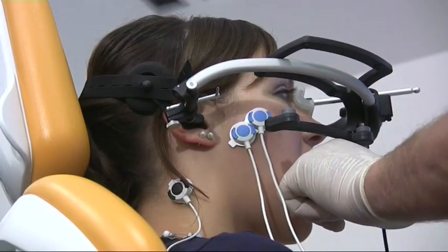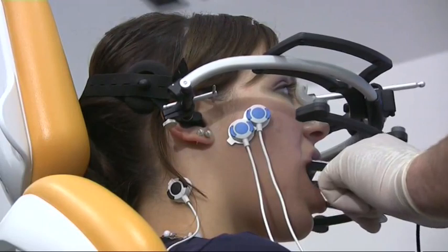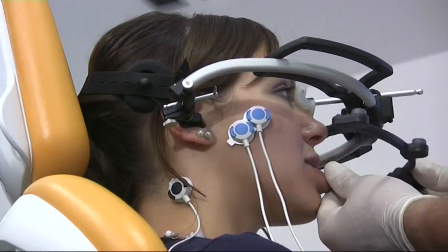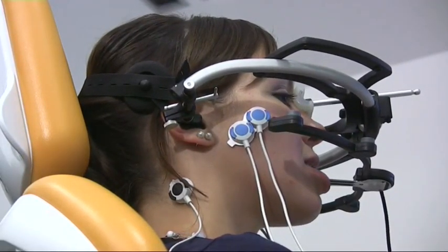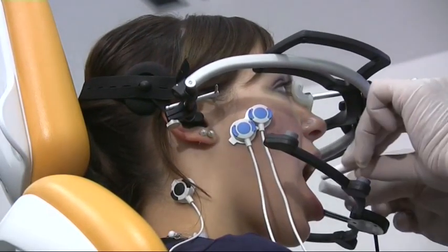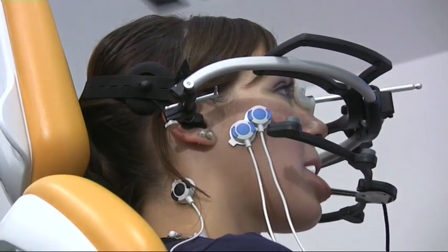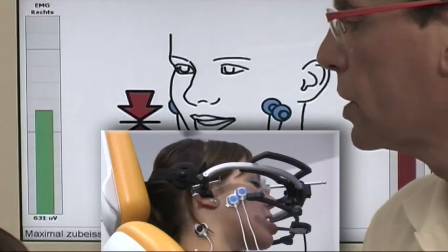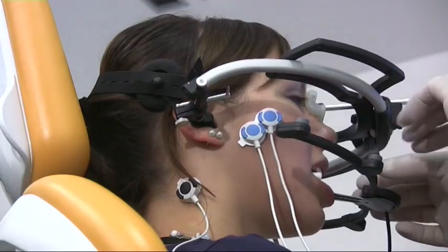Open a little wider please. Measurement carried out. Transferred to the para-occlusal spoon. Open please. Take the cotton wool rolls between your teeth and bite down once as hard as you can. Harder, harder, harder. Good. Now open wider.